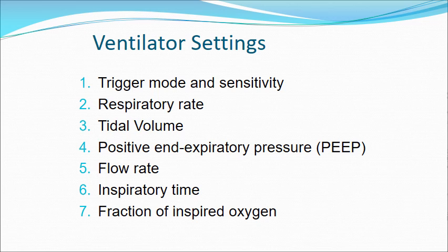Tidal volume is the amount of volume per breath, and that is set by height and gender for an ideal weight. It's different depending on whether the patient is male, female, and what their height is. Then there's positive end expiratory pressure, which on the LTV 950 is actually set with an exhaust valve, which is variable pressure. And that is the end pressure after the exhalation of a breath, which is usually kept somewhat positive. And it is similar to what a CPAP does.